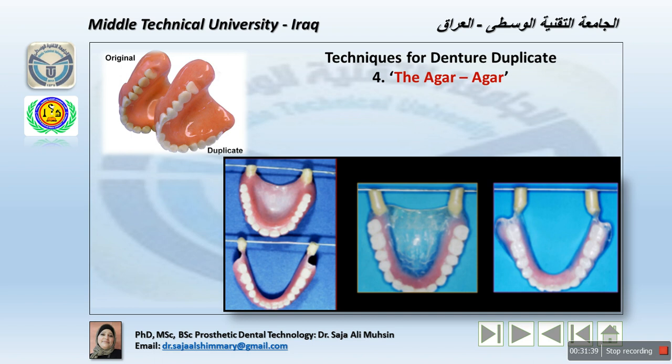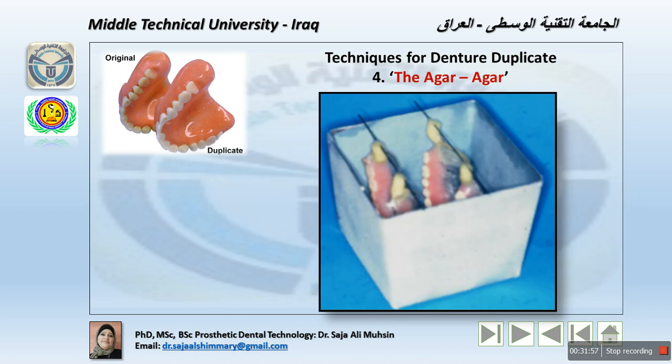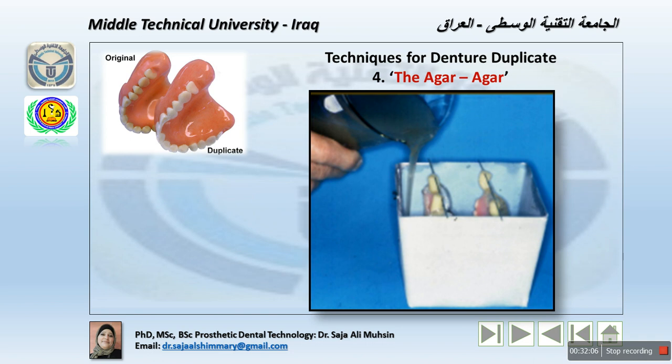The last technique is the agar-agar technique, where the dentures are suspended with a metal rod through a sticky wax sprue. After they're suspended, both dentures are placed in the agar container. Then, after melting the agar-agar to a temperature between 50 to 54 centigrade, pour the agar-agar into the agar container and leave it to set.